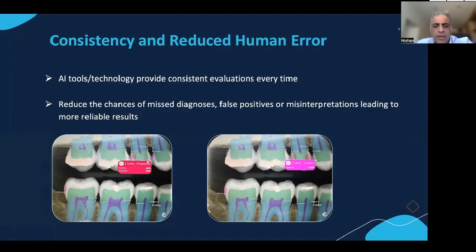Taking a couple of bite wings, areas are highlighted, early carious lesions and late carious lesions. So this X-ray that I put up is obviously the same bite wing, right-sided bite wing, showing two things. One is the early decay, which is 100% into enamel, but another one showing a late or progressed caries, which shows it's about 45% into the dentine already.